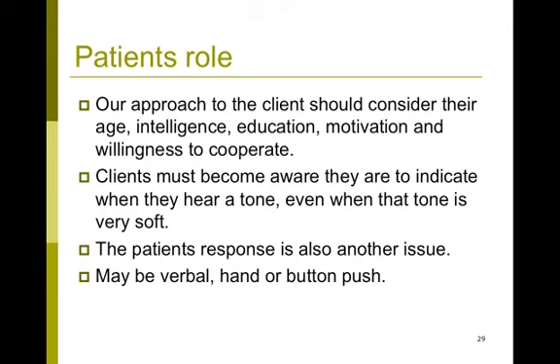The clients must be made aware that they are to indicate when they hear a tone, specifically for pure-tone audiometry, even if it's very soft. That might take a little bit of practice and frequent feedback. The patient's response is also an important issue.